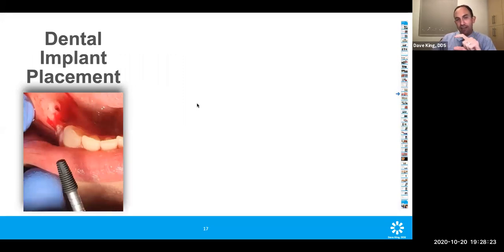Essentially, there's a scan body and a tie base, and they're different heights. And so my assistant misheard me, so she ordered the scan body and not the tie base. So the crown came out really, really tall. I'll show you that in a second.